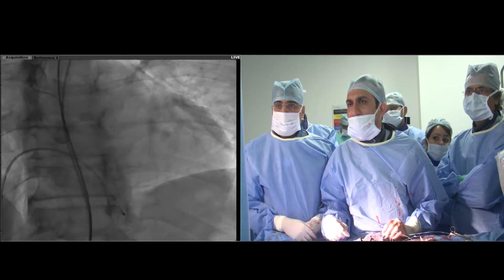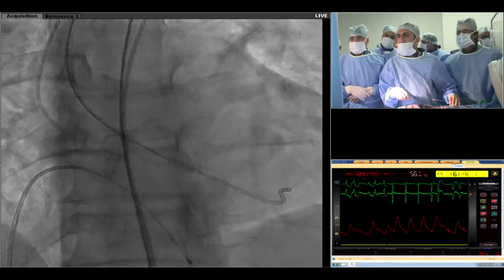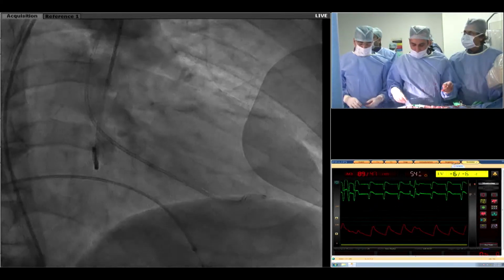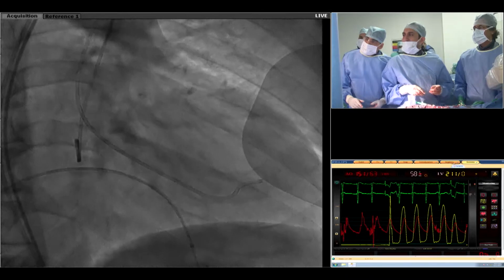So you can see how the catheter is bobbing. Can you mag up a little? Okay, come RAO please. So that's our AR2 catheter. Give me a flush. So we'll be using a pre-dilating 20 mm balloon. Yeah, good. So let us focus on the hemodynamics.